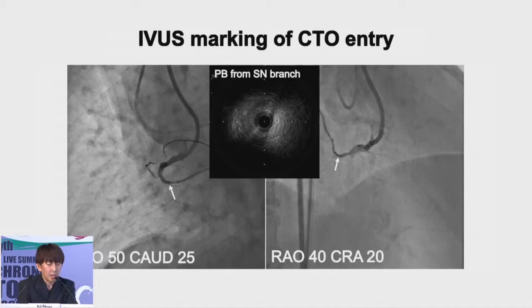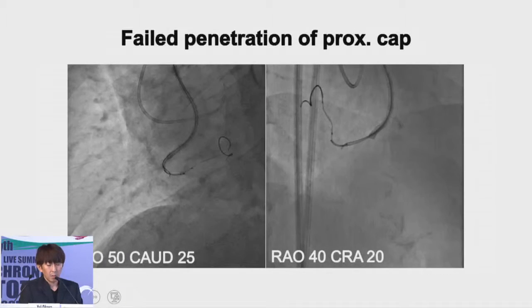So I decide to penetrate here. I tried to penetrate at this position, however, failed because there's a steeper angle at this point.